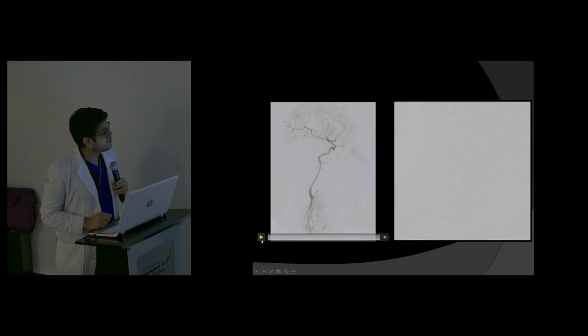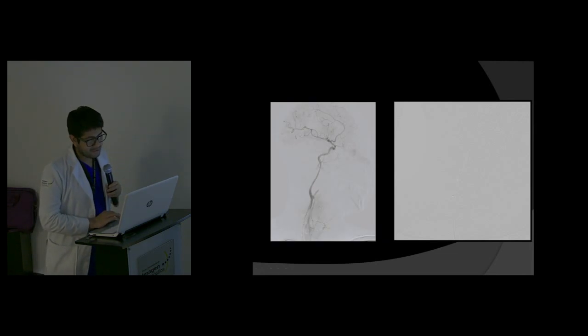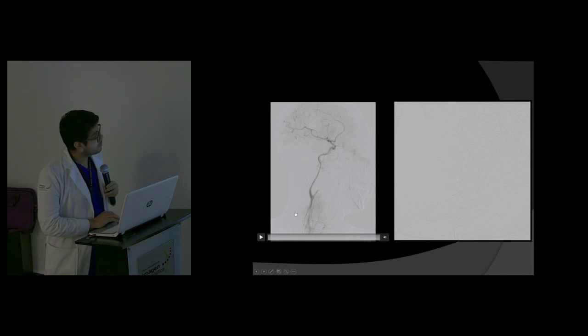Digital subtraction angiography of the right carotid artery demonstrates that there is no more flow.